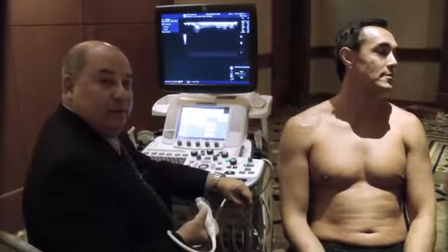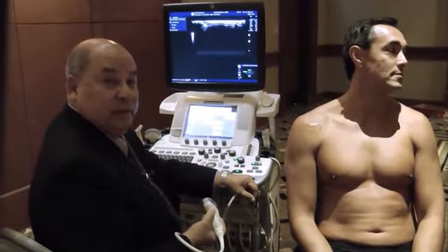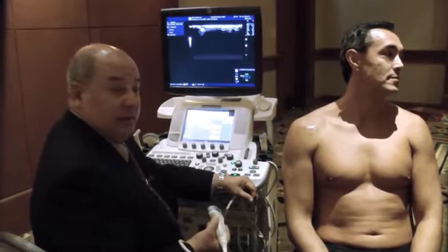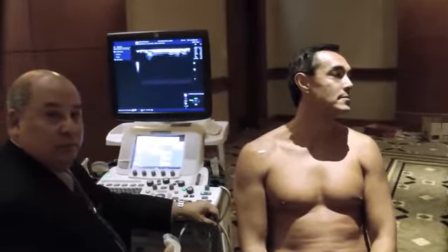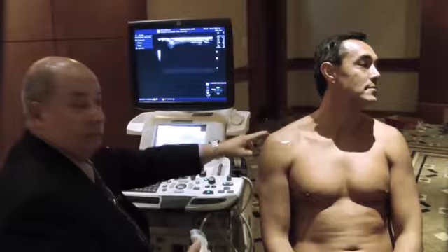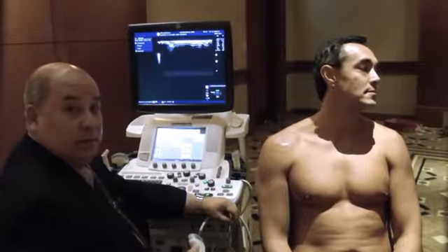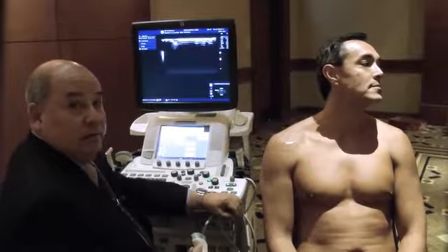For the dynamic imaging of the musculoskeletal system, let's begin with the shoulder, which is the most requested examination here in the United States. Mike, who's going to look at you right now, is our model, and we're going to begin by looking at a four-quadrant approach of the shoulder. We're going to look at the anterior quadrant, the superior quadrant, the lateral quadrant, and the posterior quadrant. In the anterior quadrant, we'll begin by showing you several dynamic explorations of the anterior region of the shoulder.